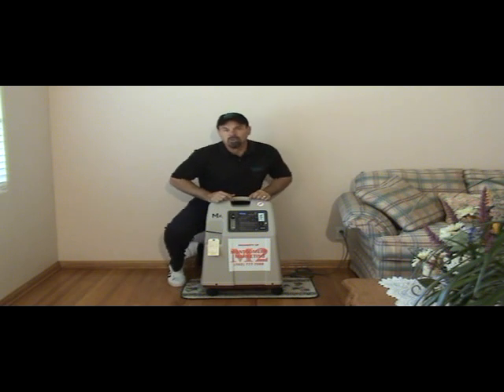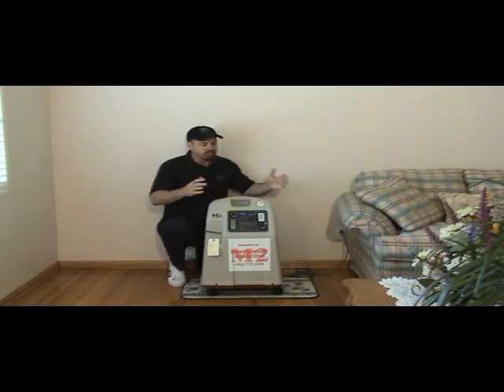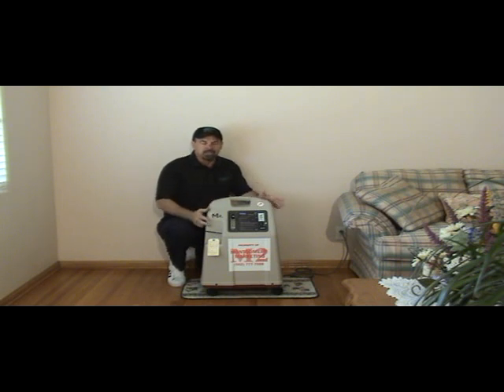The first thing you need to do when you're setting up an oxygen concentrator is find out where you're going to put the concentrator. An oxygen concentrator always works best the closest it is to the patient. You want to make sure you're close to the patient if you're going to deliver this. If the patient was sitting in this chair, this would be a good place to put it.